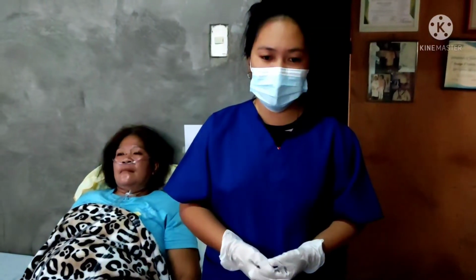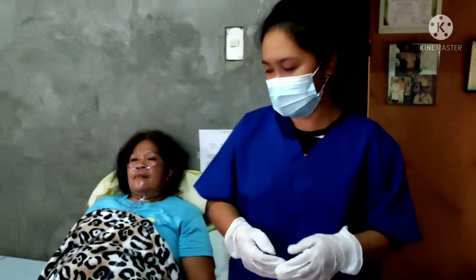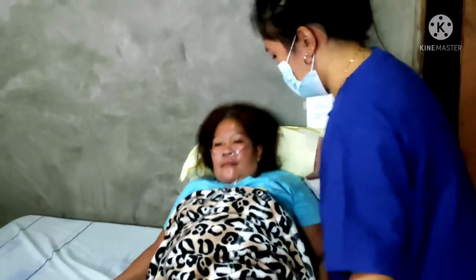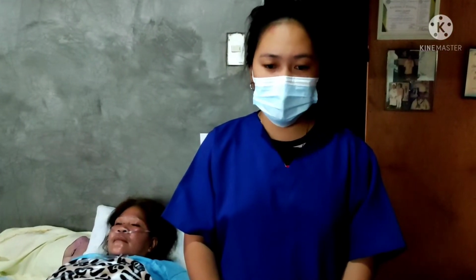Store the catheter in a clean, dry place. Help the patient into a comfortable position and perform mouth care. Reassess respiratory status and oxygen saturation for improvement. Call for help if any abnormal signs and symptoms appear.